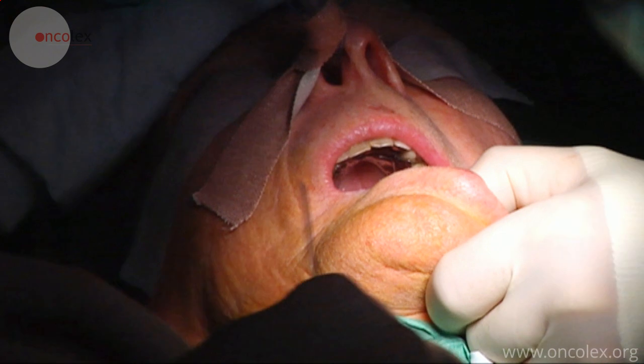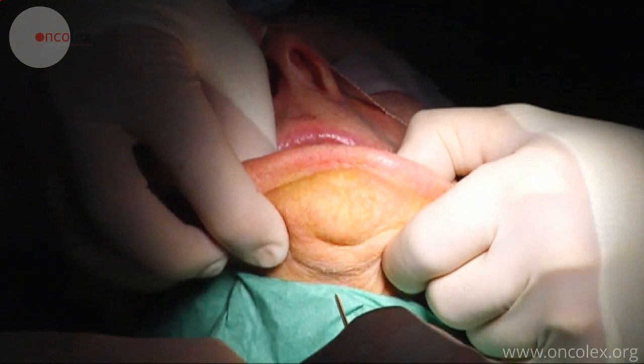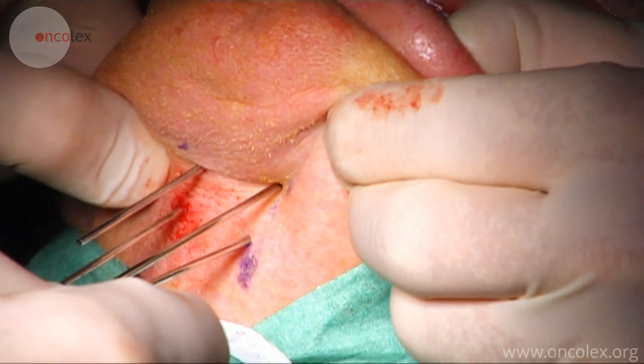This is a video demonstrating the placement of plastic catheters for brachytherapy of the tongue. Four guide needles are first placed in the tongue from the underside of the chin.